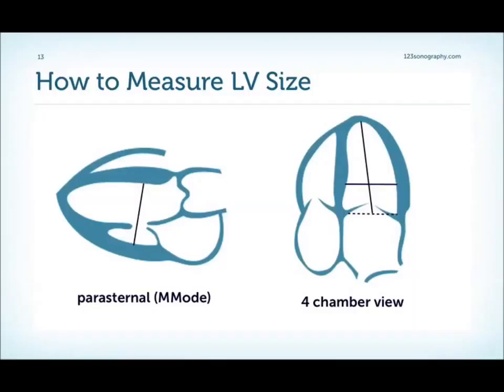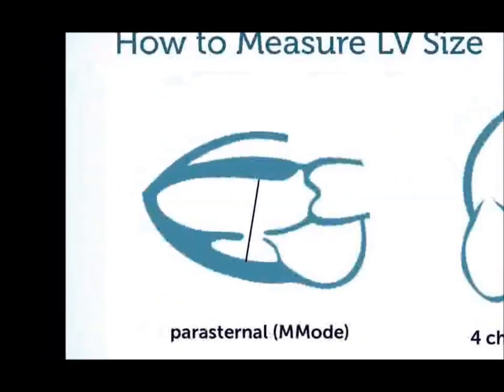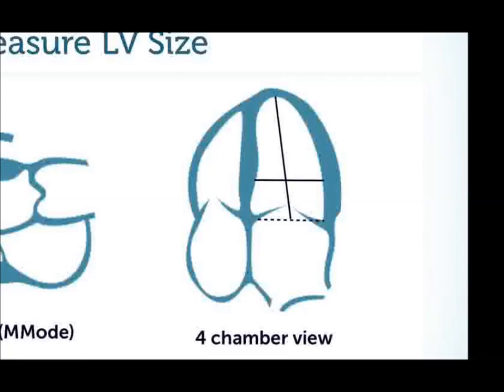The diameter of the left ventricle has traditionally been measured using M-mode from a parasternal approach. But you can also measure diameters using the four-chamber view, for example. The following demos will now show you how to measure diameters of the left ventricle.